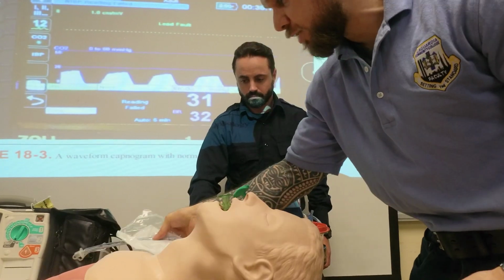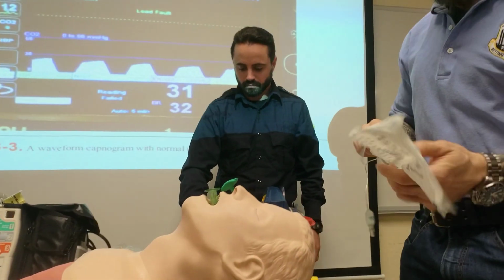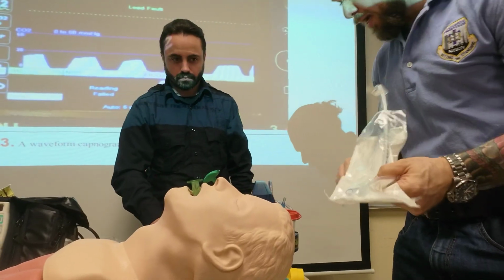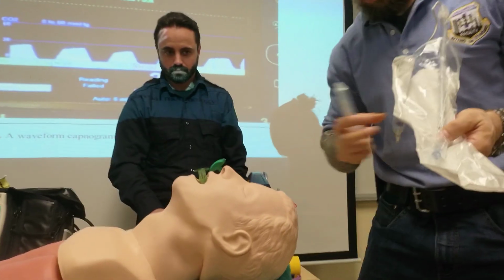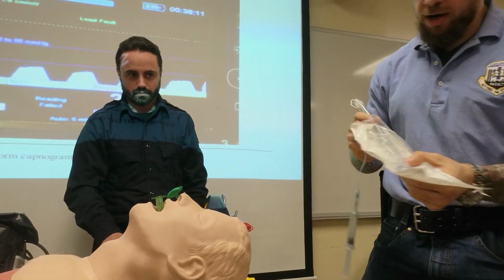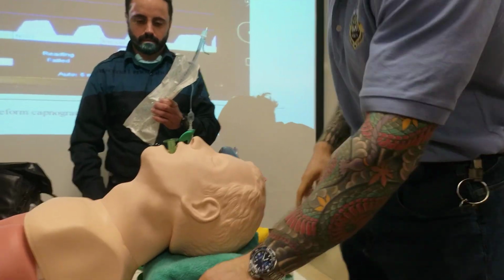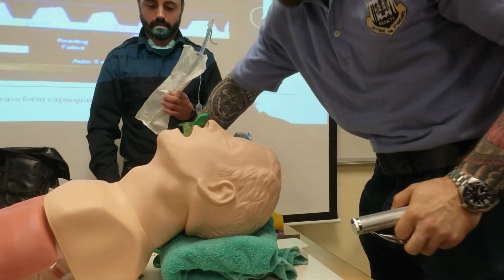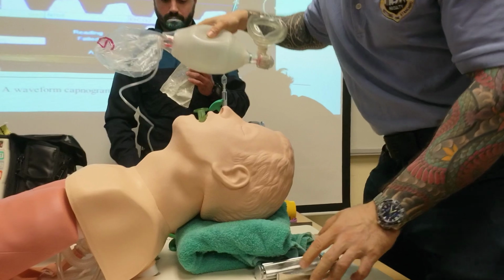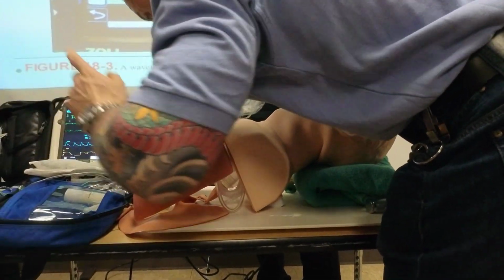The next thing you're going to need is the tracheal tube, straight, with a cuff, and you're going to need your syringe, which is 10 cc. I already pre-molded it in the package, and I put some lubricant at the bottom. My partner over here is going to hold it to the side. I've got my blade, and let me see if I have an extra one. I think I put it in the other bag.